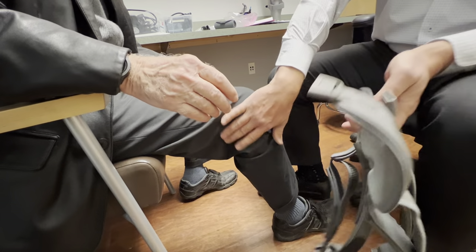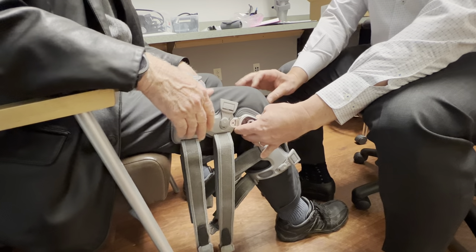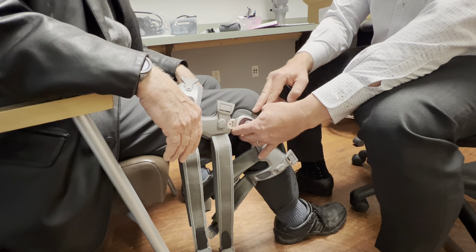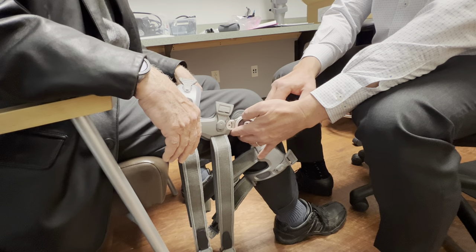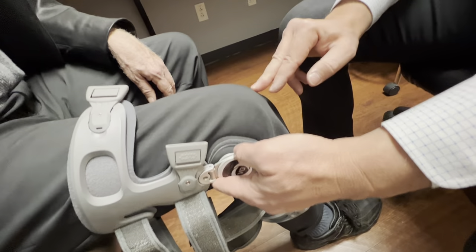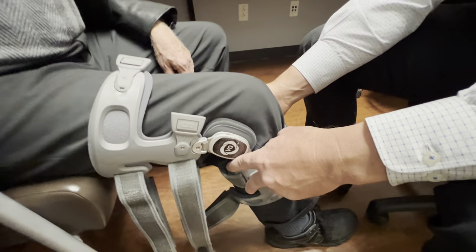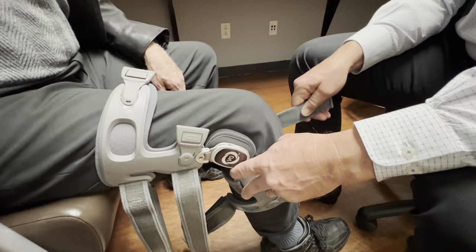There's a little tendon back here you can kind of feel with your hand. You want the pad to be way back near that tendon, directly on the side of the knee. I always say look for the patella, come straight over from the patella, and you should intersect the very middle of the pad. The very first strap you want to put on is this strap right behind the leg, way up behind the knee.